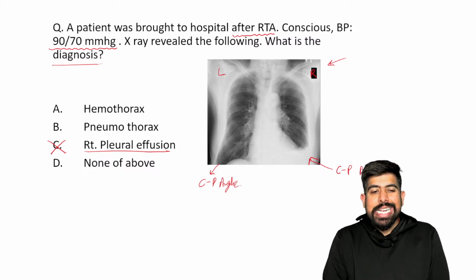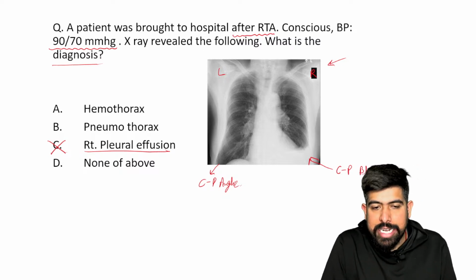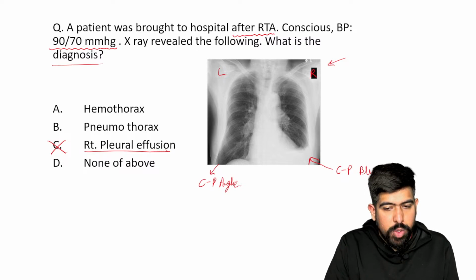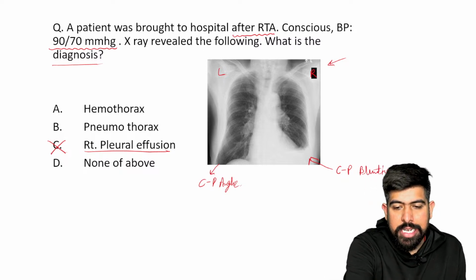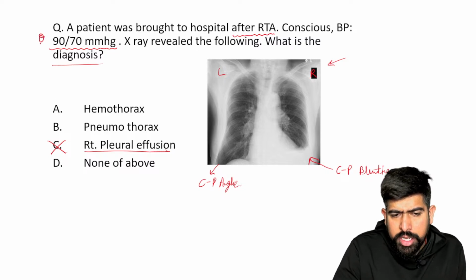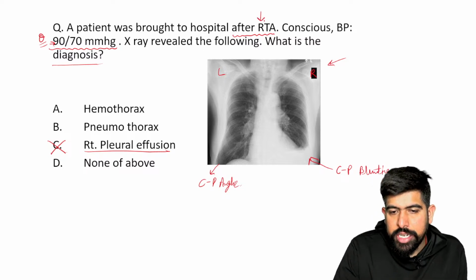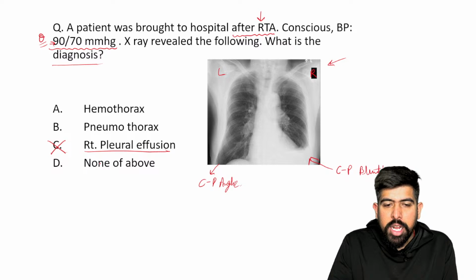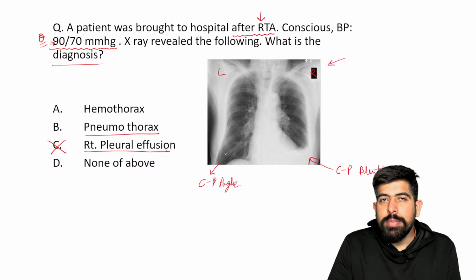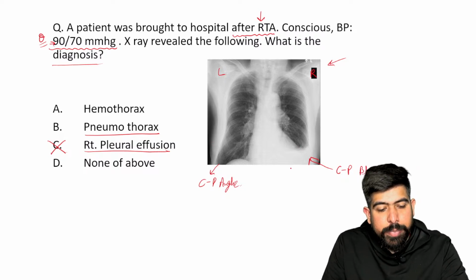Is it a possibility that the patient had this pleural effusion, and then had the RTA, and of course the blood pressure would not be decreasing? The blood pressure mentioned here in the clinical history is your keyword, and this is also the history after the RTA, so this is also possible. Of course, some of you are asking, sir, is it possible it is pneumothorax? Please remember, is it possible the CP angle will be blunted in pneumothorax? Just let me know in the chat box.